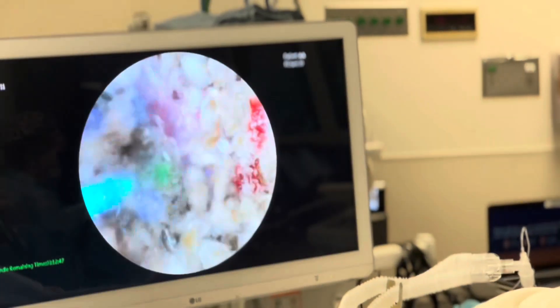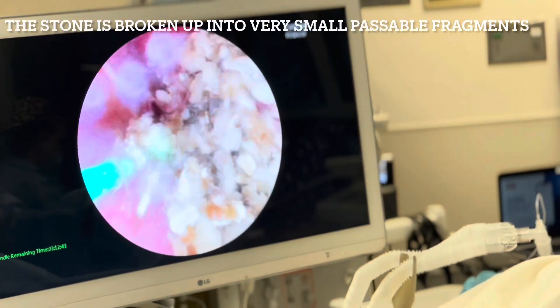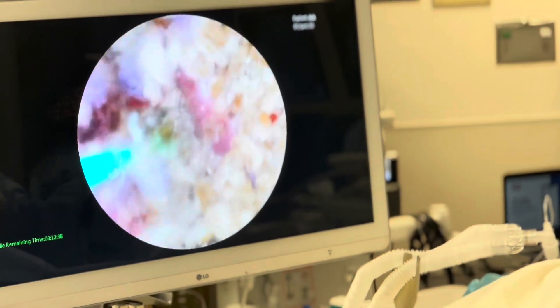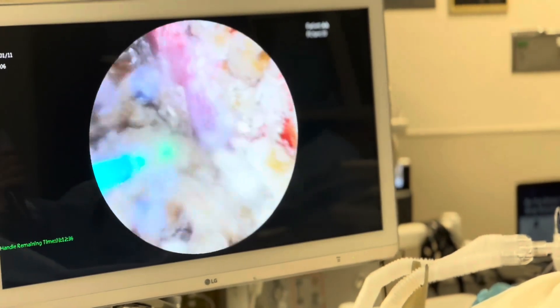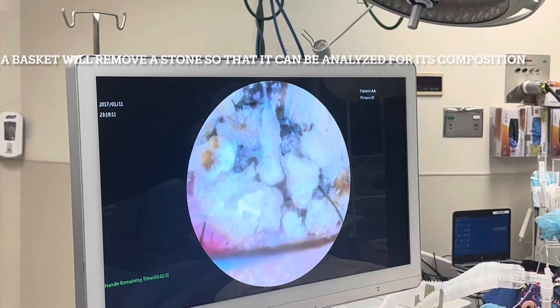The stones have been broken up. The big stone — you can see now they're all tiny, tiny little pieces. We're grinding them up into little pieces. These are all passable pieces. We're going to basket a stone. We've broken up the stones into small pieces.